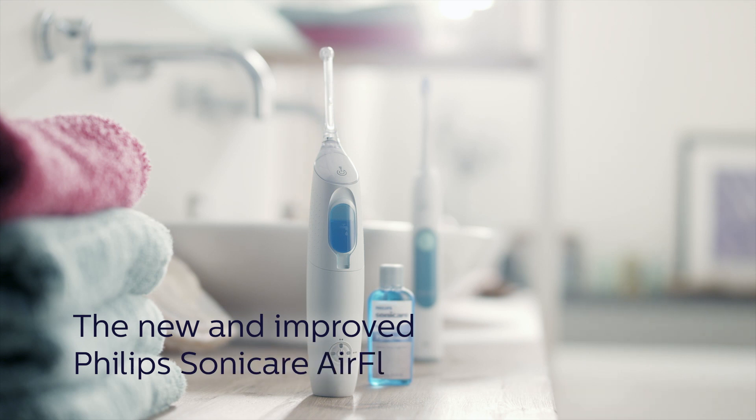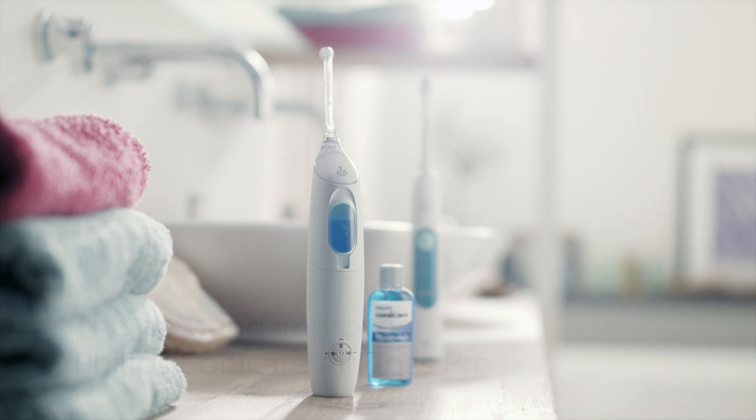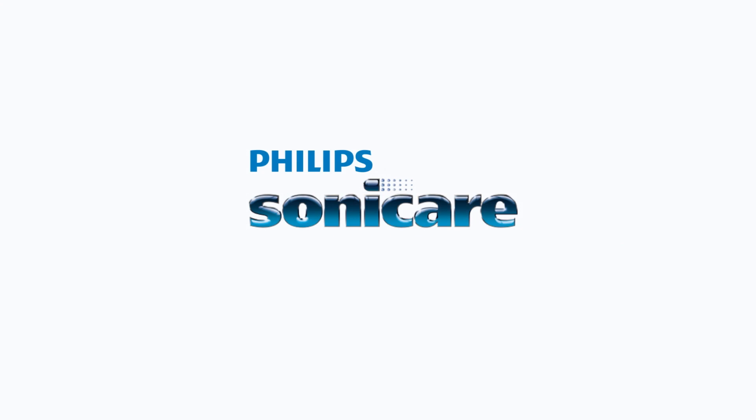The new Philips Sonicare Air Floss Pro: the effective interdental cleaner that your inconsistent flossers will use. Innovation and you. Philips Sonicare.